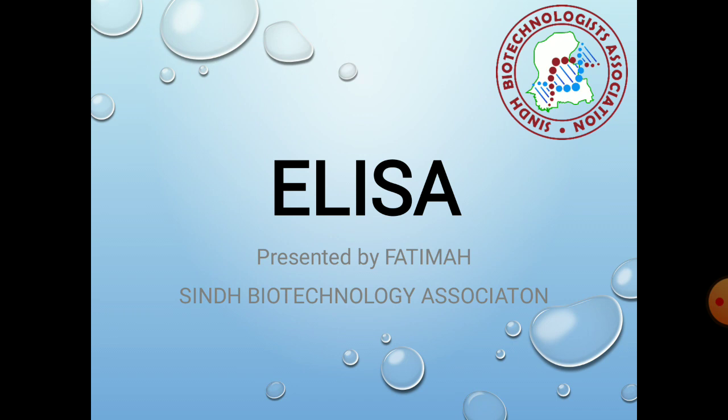In today's lecture, we are going to discuss ELISA, the enzyme-linked immunosorbent assay. This assay is used as a solid phase type of enzyme immunoassay to detect the presence of ligand. ELISA has been used as a diagnostic tool in medicine, plant pathology and biotechnology, as well as it is helpful in quality control checks in various industries.